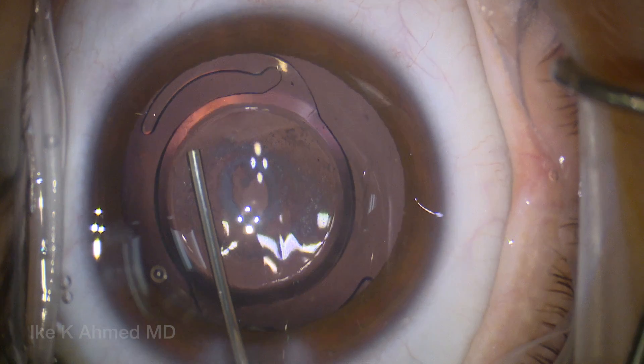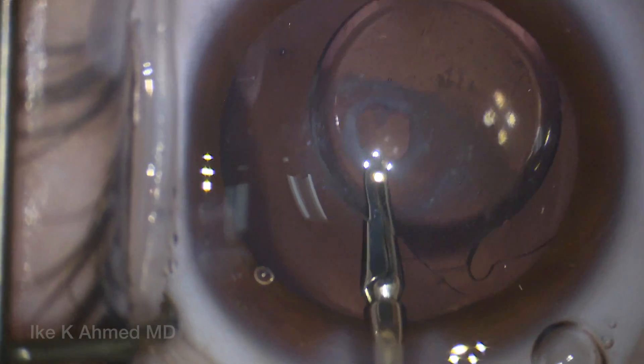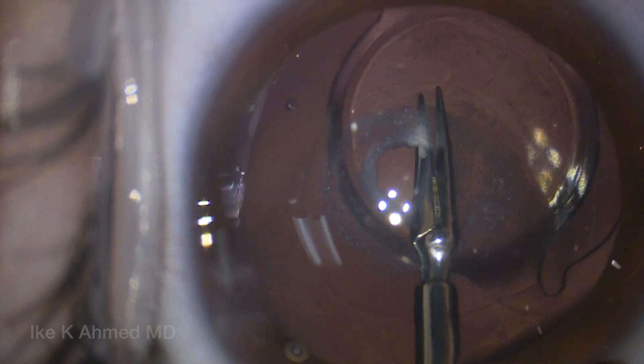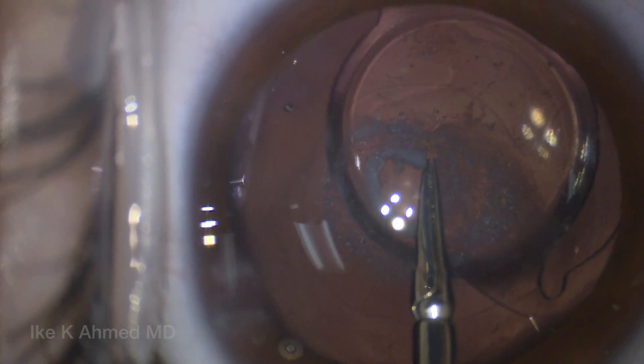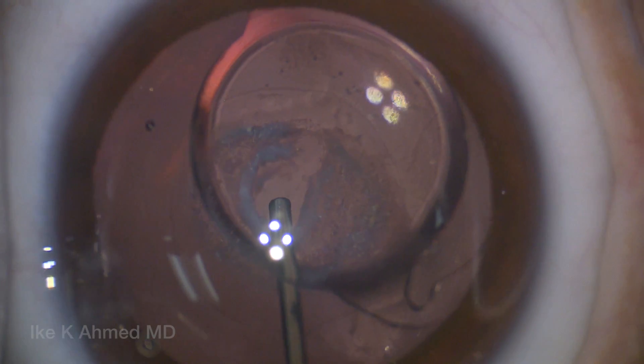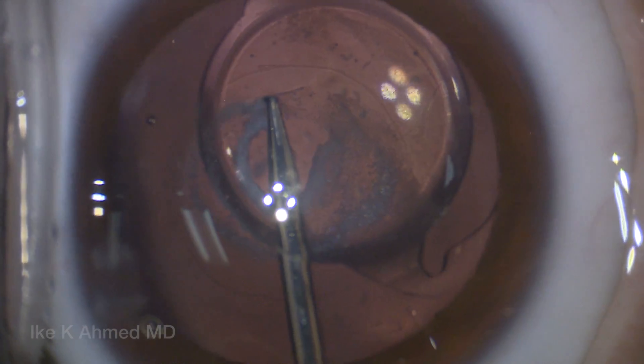Most posterior polar cataracts do not have a deficient posterior capsule. Usually the posterior capsule is very thin but not deficient. Here we have somewhat of a thickened posterior capsule with some lens material present as well as some anterior hyaloid opacities. This is a variant of a classic posterior polar opacity.